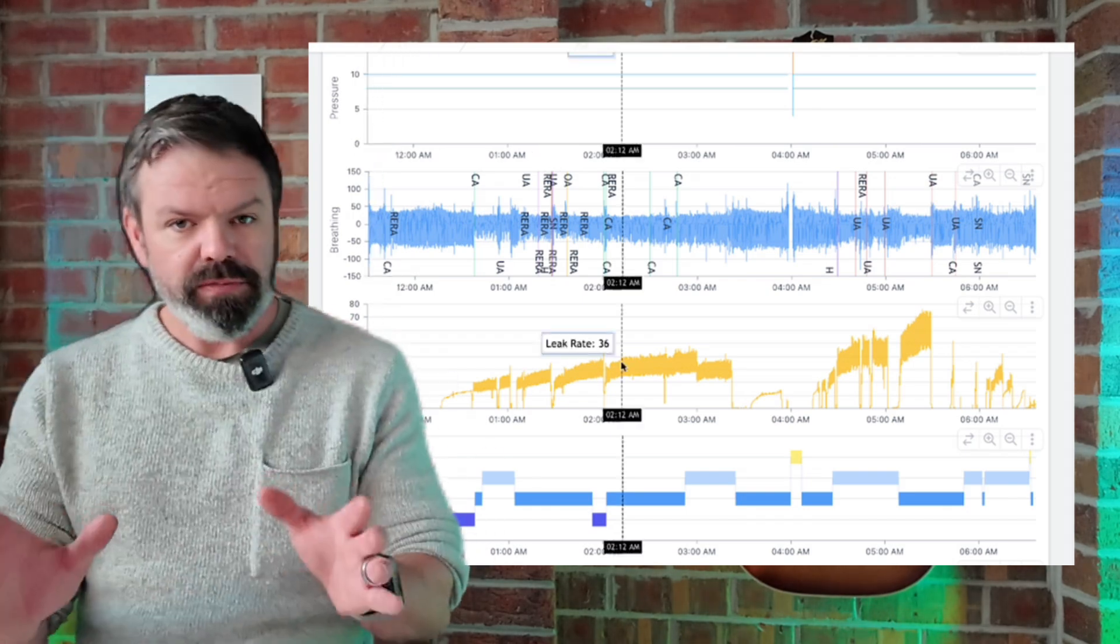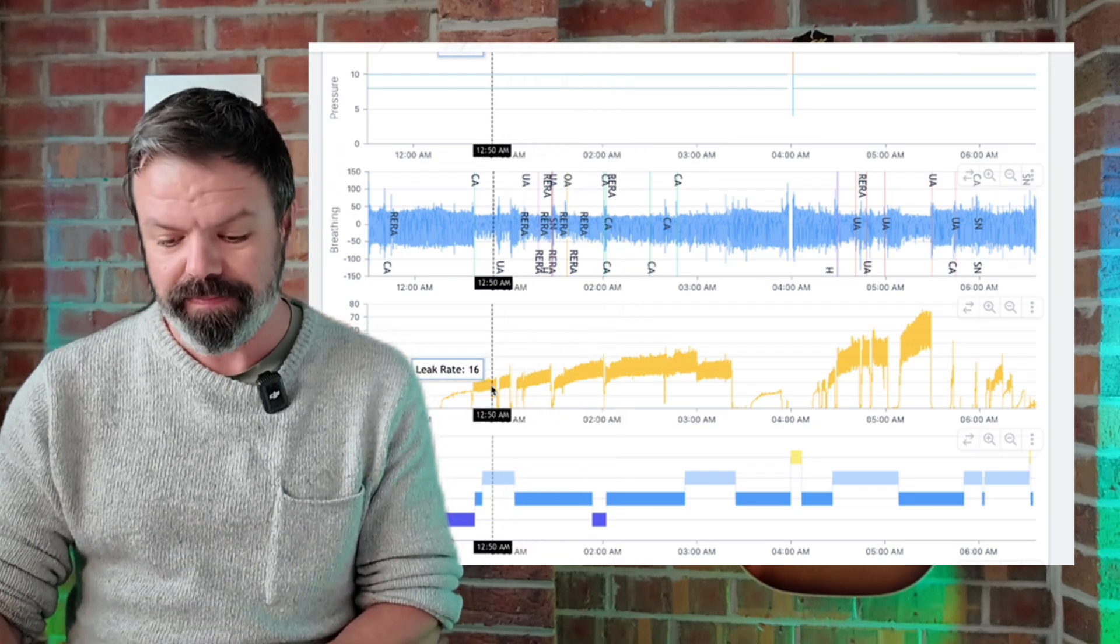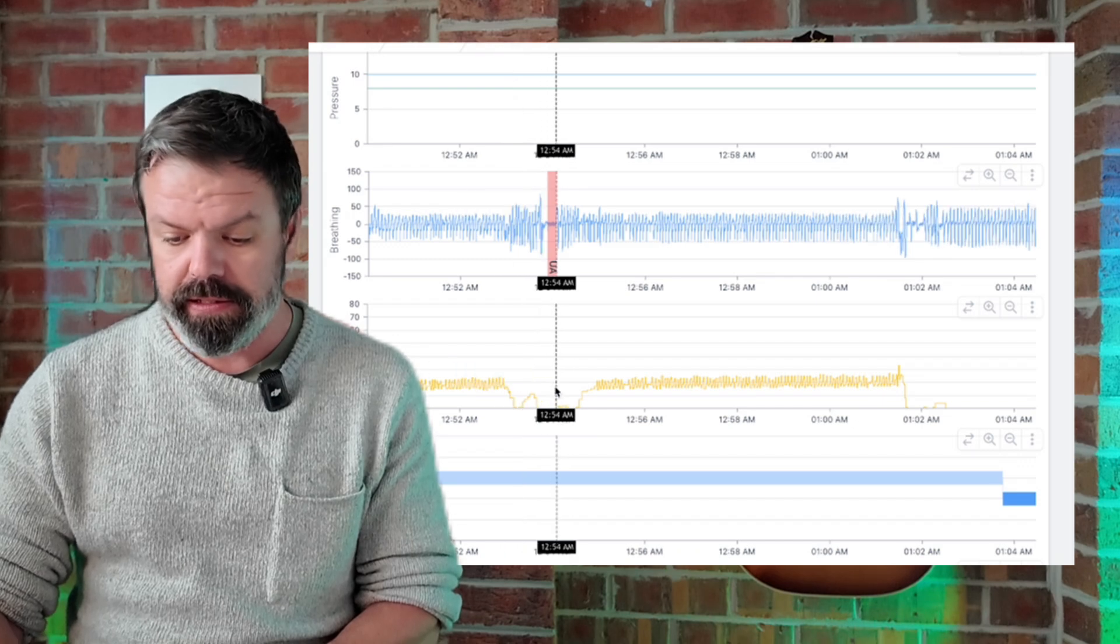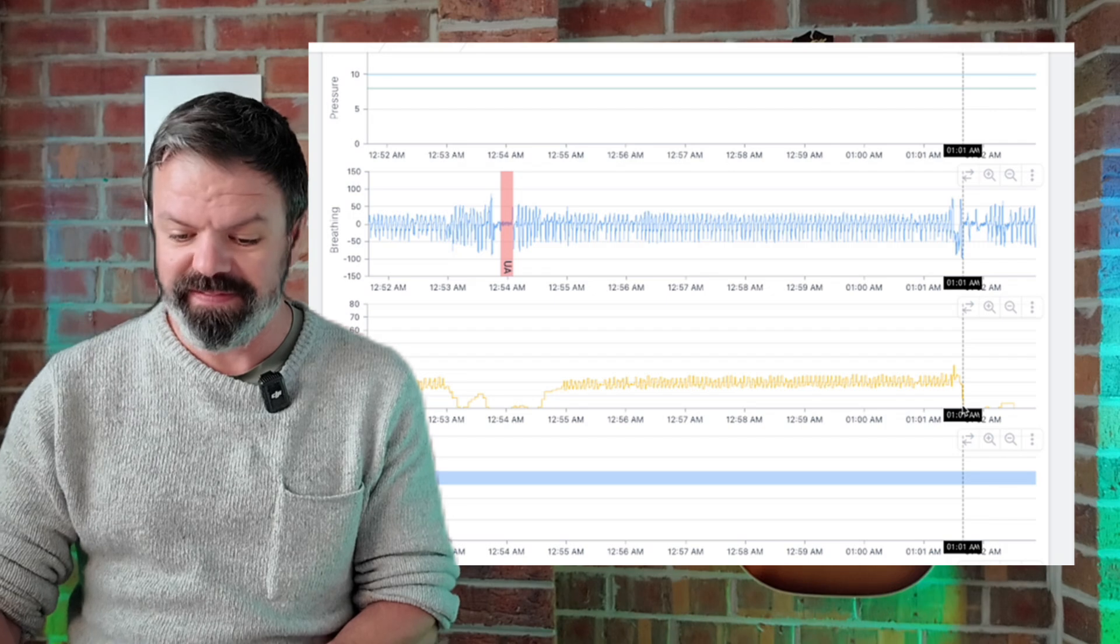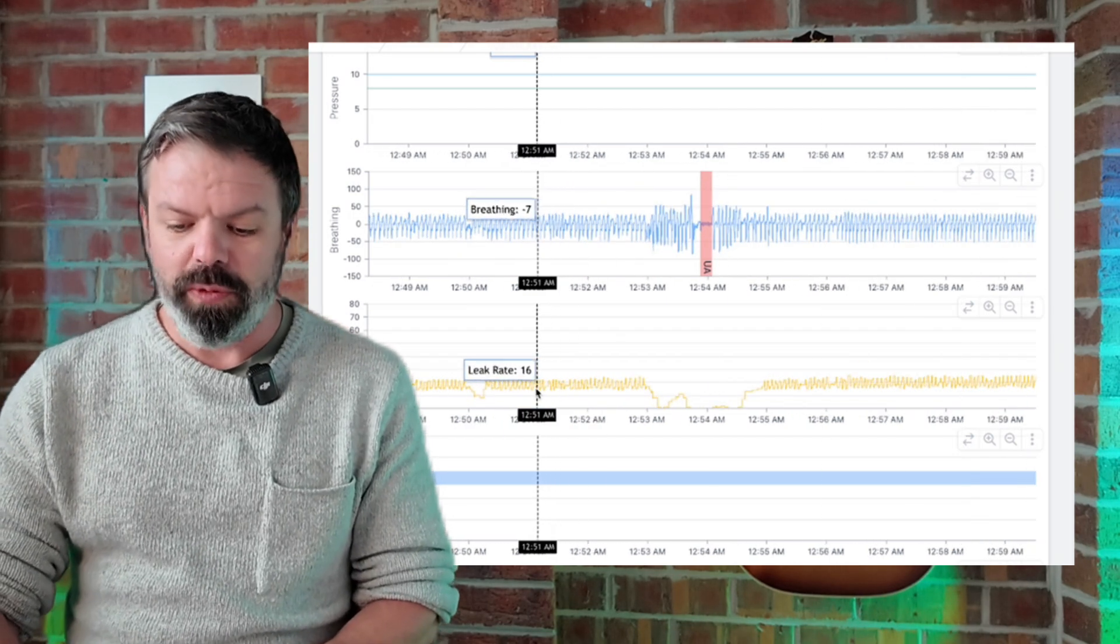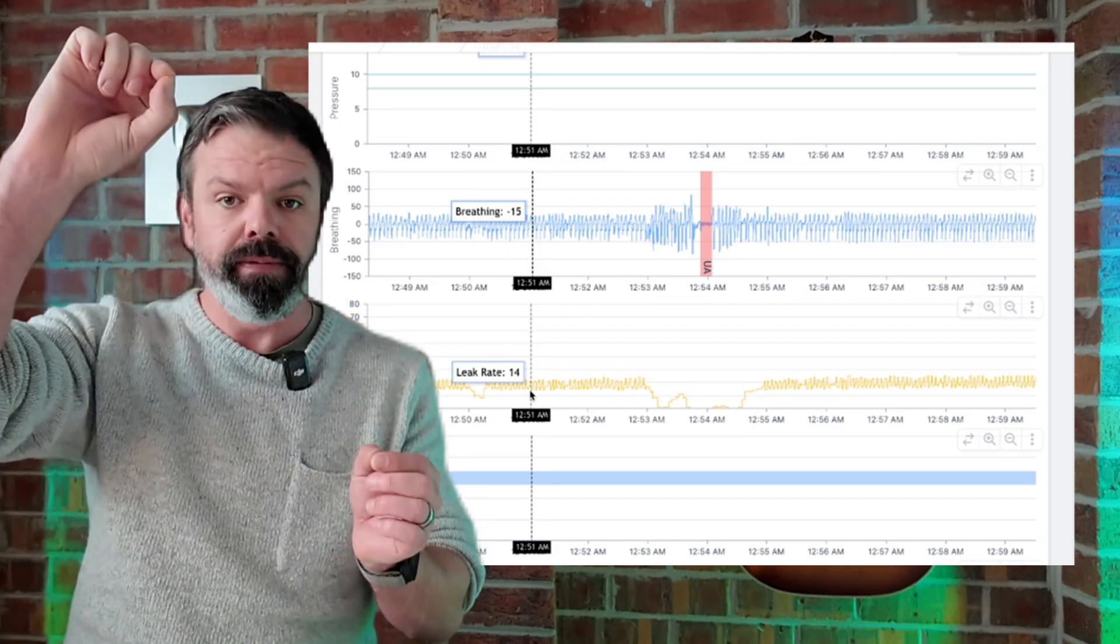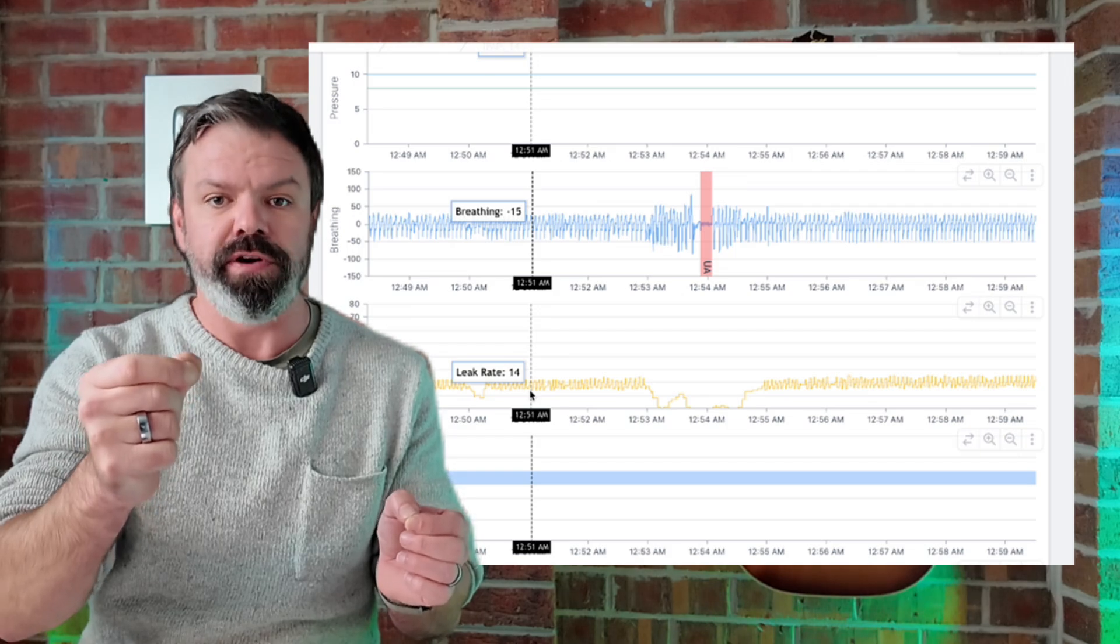Now when it comes to mouth leak, what you're going to see is this. I'm just going to zoom in here by clicking and dragging. What you'll normally see is the leak shoot up, but then it just falls off a cliff - boom, back down to zero.